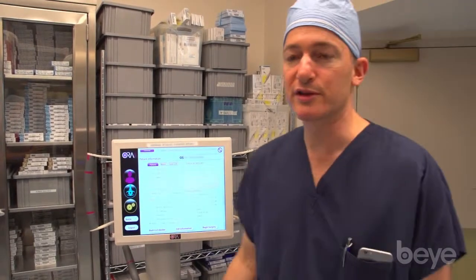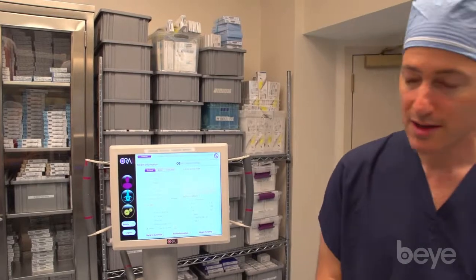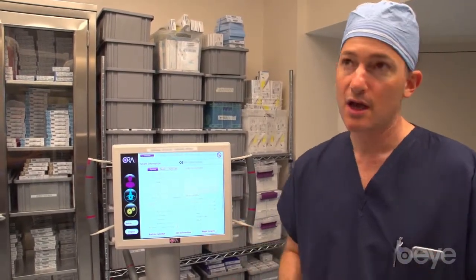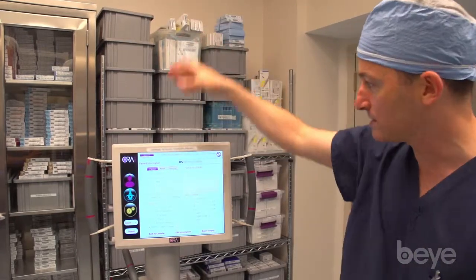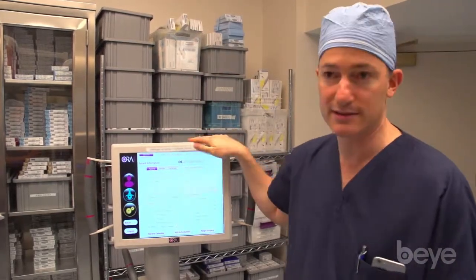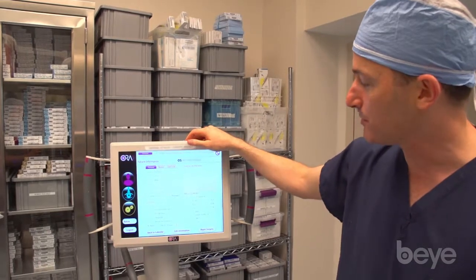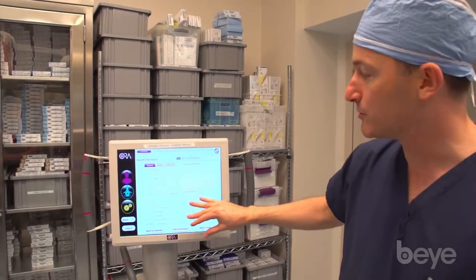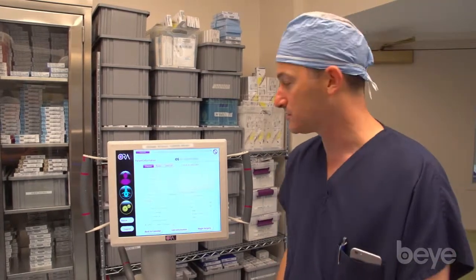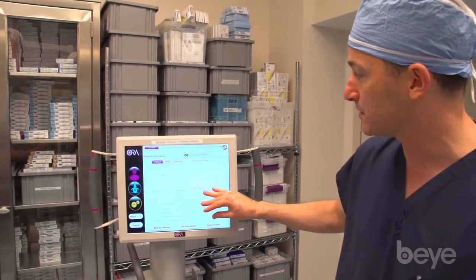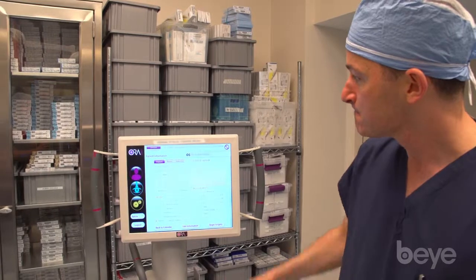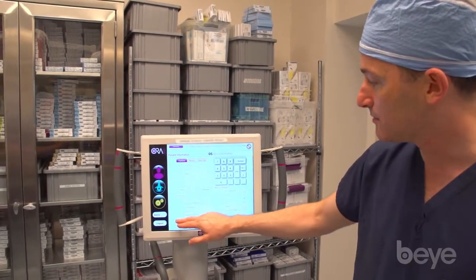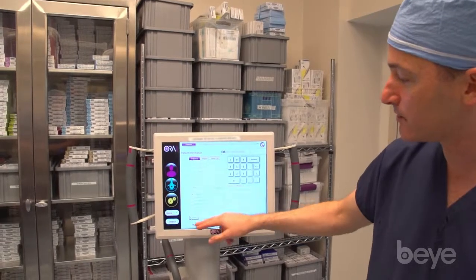When you start the surgery, the first thing we do is enter all the patient information. This is usually done by my surgical coordinator in the office, beamed into the cloud, and once the machine turns on it pre-populates — saving a lot of time in the OR. This includes the eye, measurements from your IOL Master or Lenstar for internal comparison, and you can edit all this information and mark whether or not you're using the second eye.